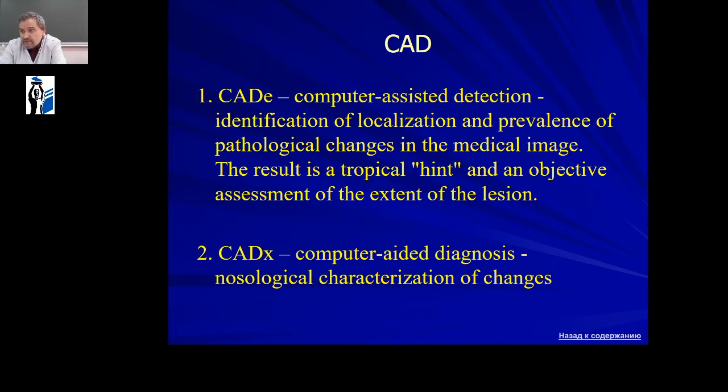This work of the CAD system is already approaching what is now more and more in demand, namely the artificial intelligence system. This system works when the boundary of visual perception has been reached and we cannot move further to the correct diagnosis.